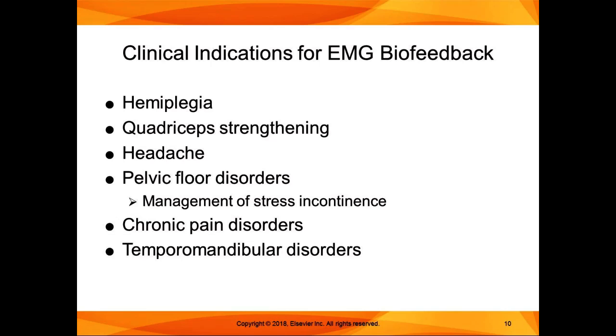And you use an intracavity device with that, where it's actually inserted into the vagina or sometimes into the rectum to detect the pelvic floor muscle contractions. And it's a specific device. Chronic pain disorders and temporomandibular disorders. So the chronic pain and temporomandibular disorders are like the headache, frequently inhibition usage.